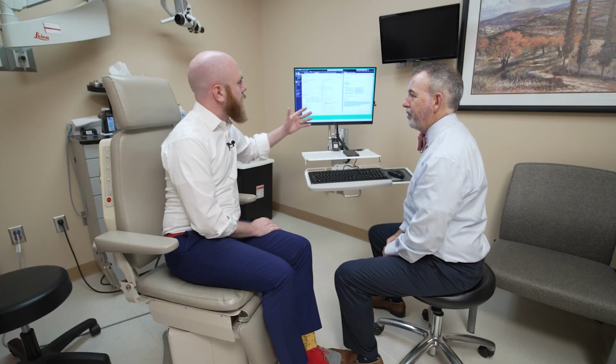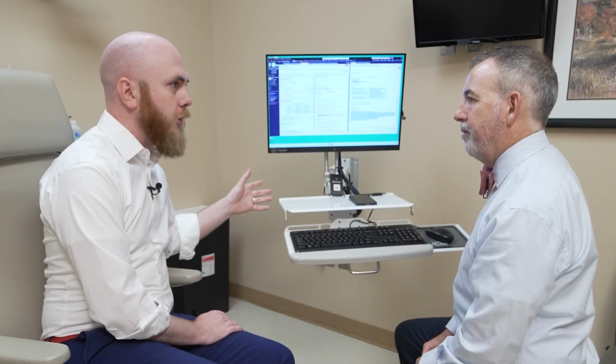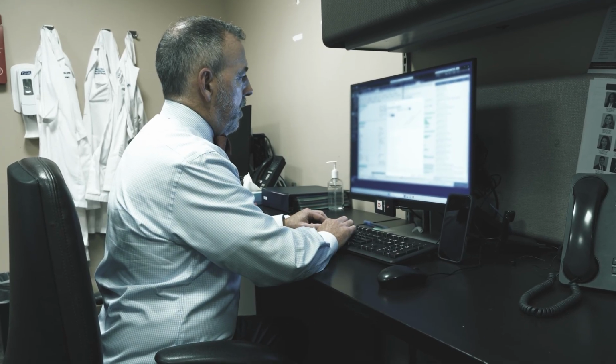I see a brief outline of kind of what I talked about, some bullet points there, and a paragraph under the assessment and plan. How does that compare to what you would be able to write? So the more I've used it and the more I correct things or change things, the more it becomes like what I would like to use from my notes.